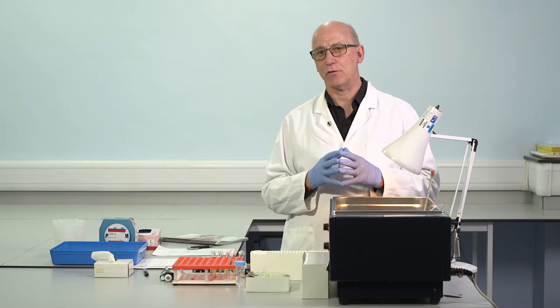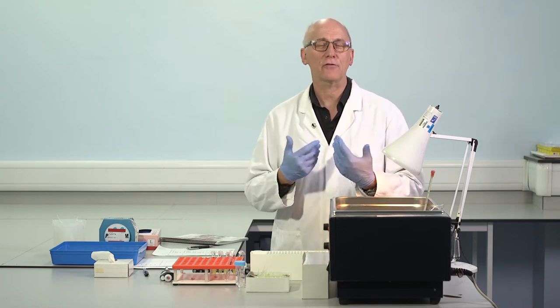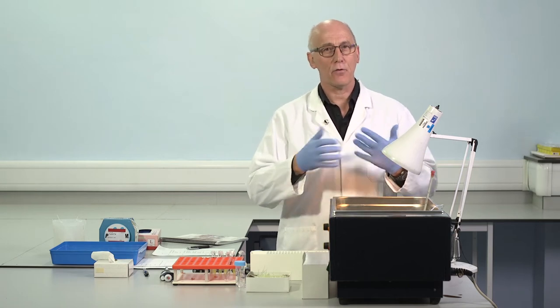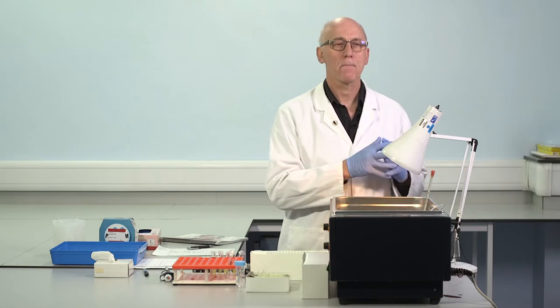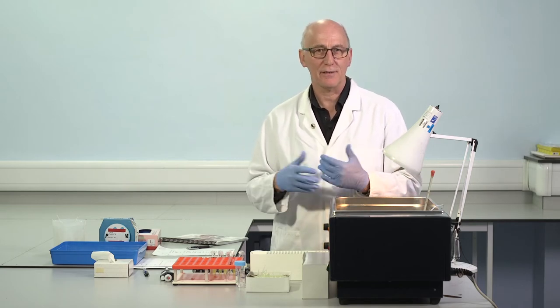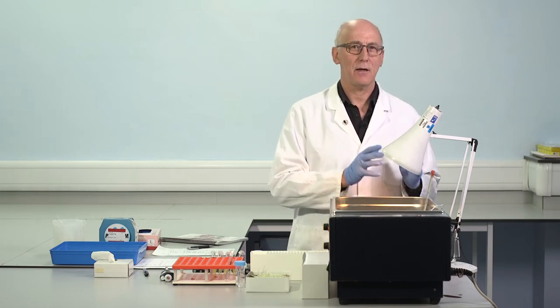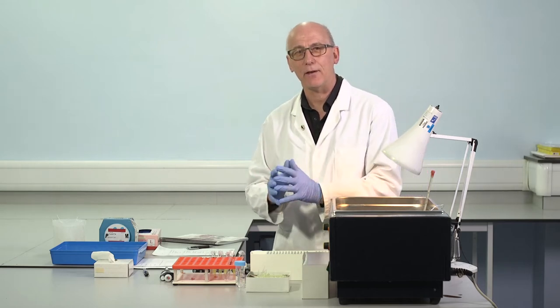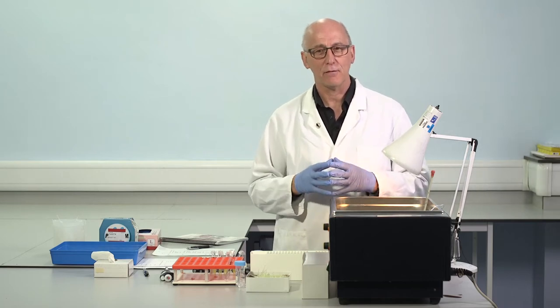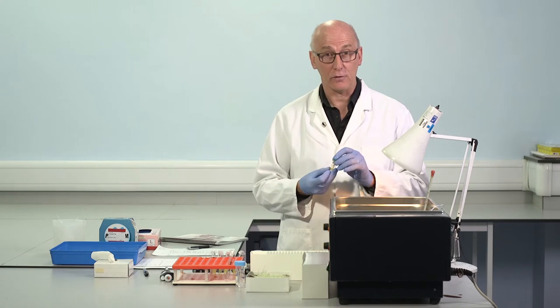It's key, absolutely essential, that each of those aliquots of the control material is identical to all the others, as close as we're able to make it. So we should treat each of those aliquots in the same way. So we thaw and pool, we make a single pool of all the material. We aliquot in a series of vials, and all of that aliquoting is done in small volumes. Half a mil is acceptable, 1 mil is acceptable. In small volumes, and once all the aliquoting is completed, then those samples are transferred all together into the freezer for storage so that they're aliquoted together, frozen together. This way there is a better chance that they are identical to each other in the conditions that they've been exposed to.